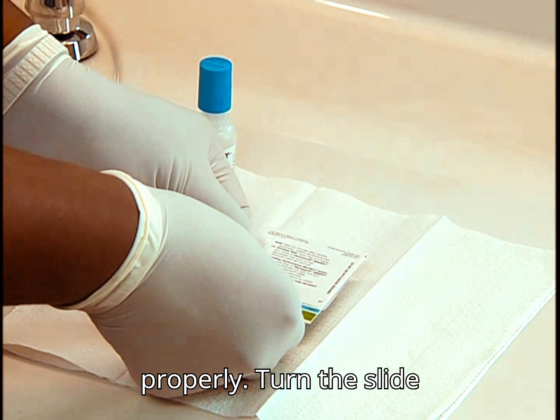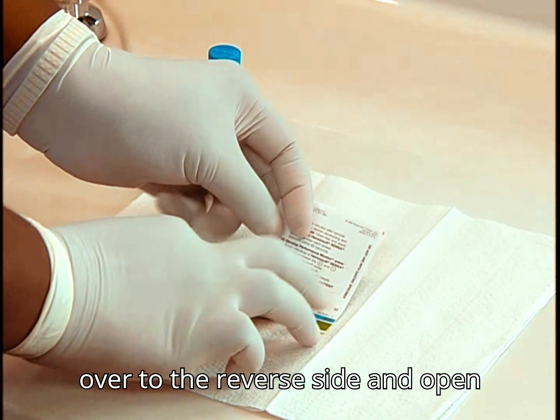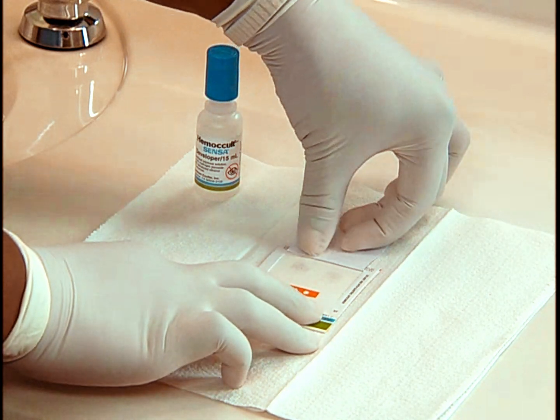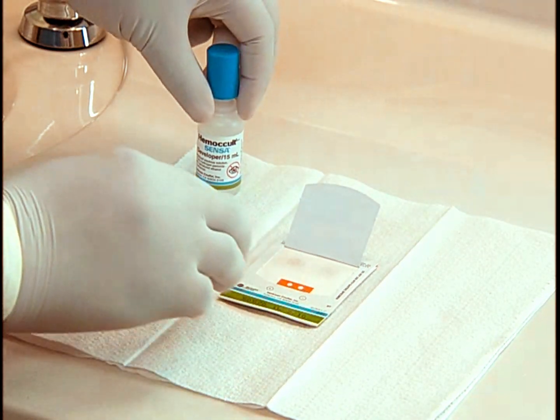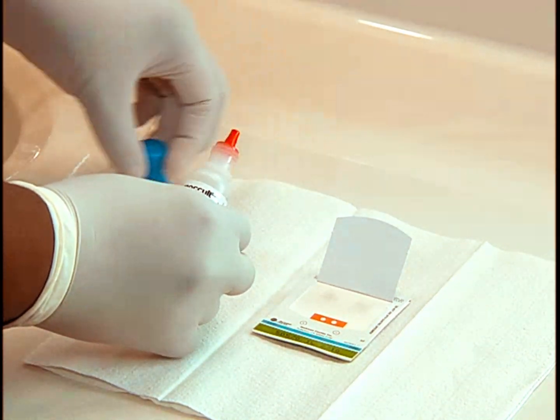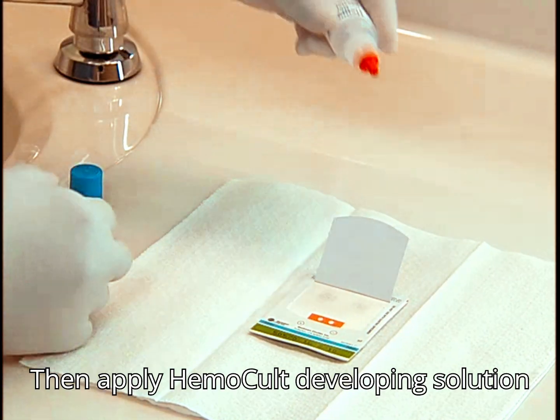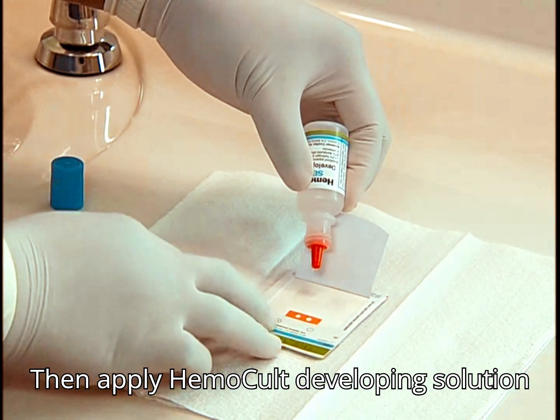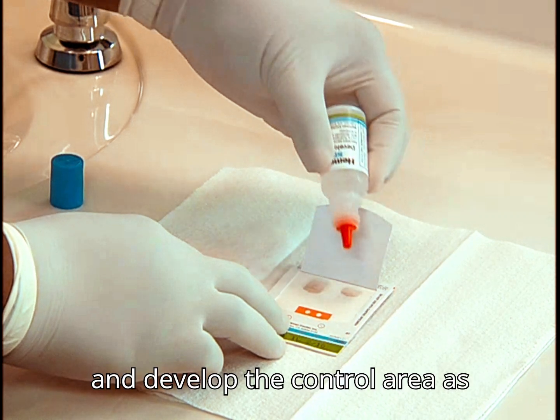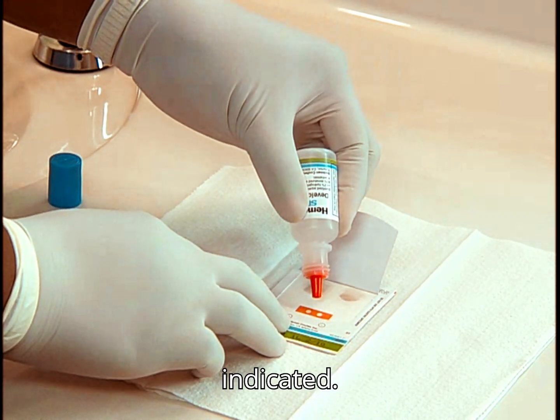Turn the slide over to the reverse side and open the cardboard flap. Then apply hemocult developing solution following the manufacturer's directions and develop the control area as indicated.